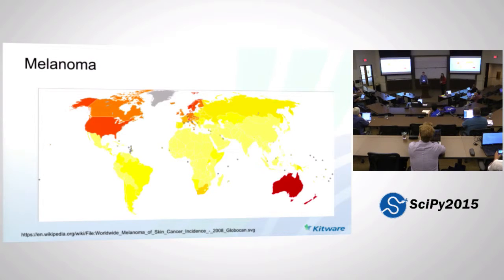In countries in Africa that maybe have a decent amount of incidence, it's much more difficult to screen for because it tends to come in more advanced stages quicker. Dermoscopy is not quite the tool that it could be, and also just because of access to healthcare resources, you're not going to have as many pre-screenings with dermoscopes.